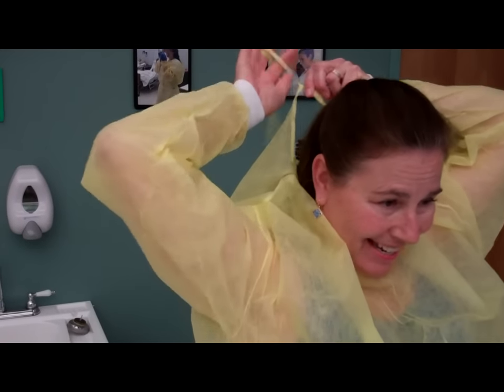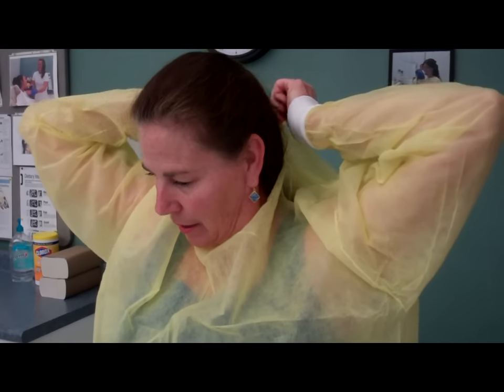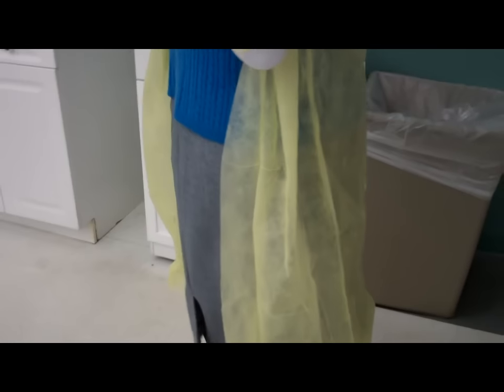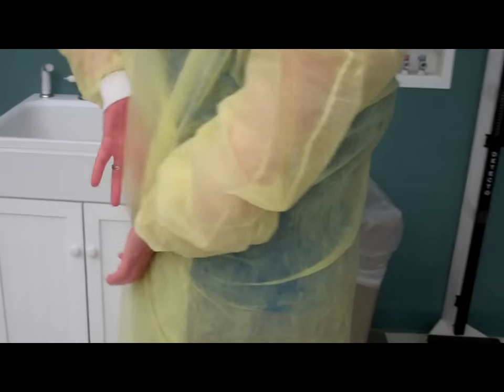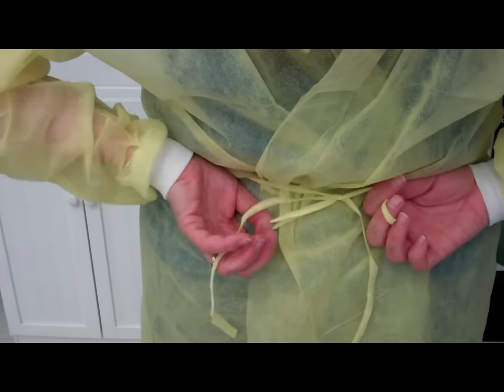Please be extremely careful to tie in a bow as opposed to a knot. A knot does not allow you to get out of your gown. Next, you want to make sure that the back is covered as much as possible. Then we proceed to tie the waist in a bow as opposed to a knot.